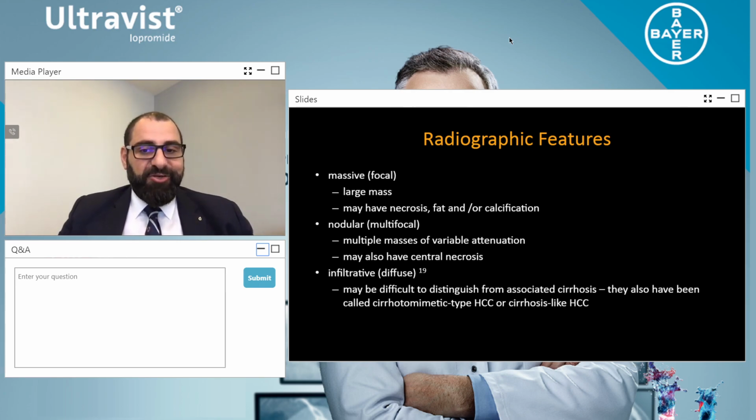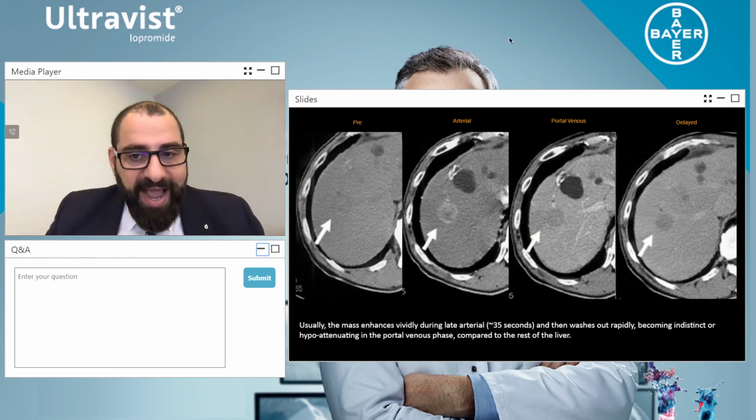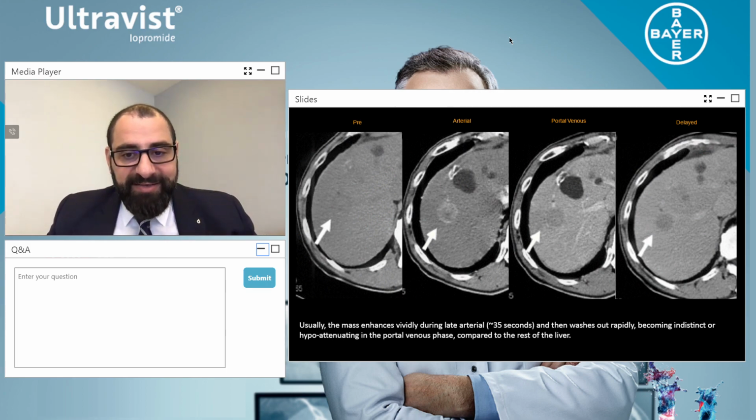So let's take a good look at this example. Here I have a hypodense mass relative to the liver parenchyma. In the arterial phase, I see it's enhancing, but it doesn't enhance like a hemangioma, though it does look very similar. In the venous phase, the wall is still enhanced. In the delayed phase, the wall is enhanced, but the lesion has gotten smaller relative to the liver parenchyma. This means the lesion is still enhancing, but it's very slow enhancing.